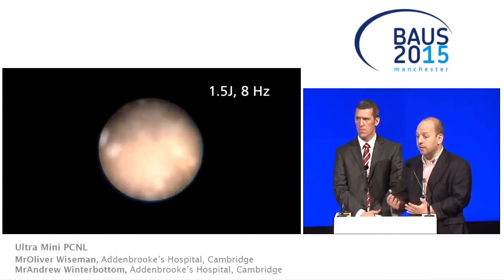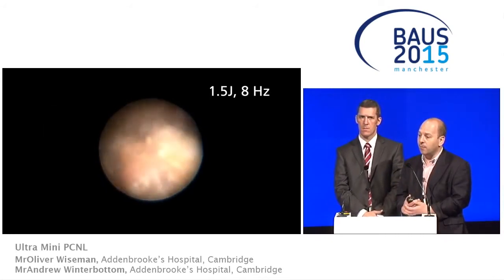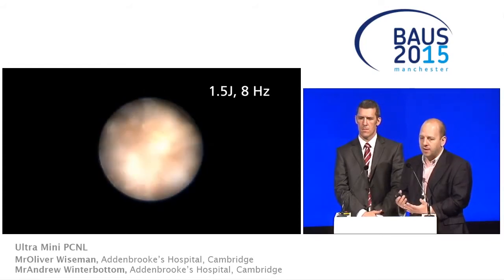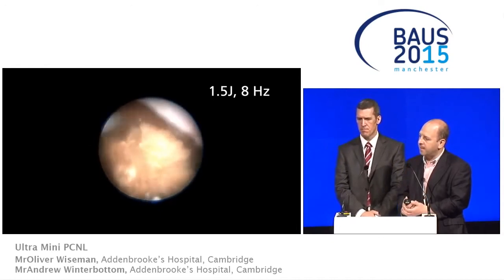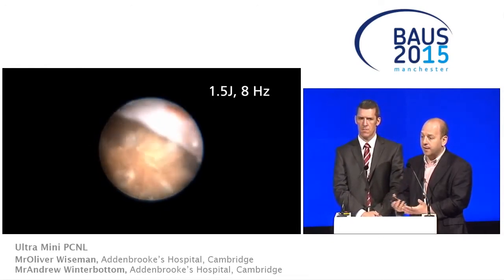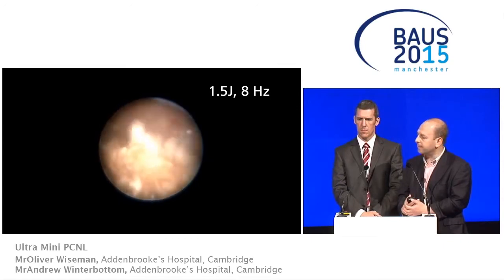You haven't got the concerns which you would have with a flexi of not being able to gain access in 1 in 10 cases. But don't forget, this was our first case, so I would suggest that as our experience with it improves, we had a theatre full of observers, we had Janak who was taking us through it, I think that our operation times will certainly come down.